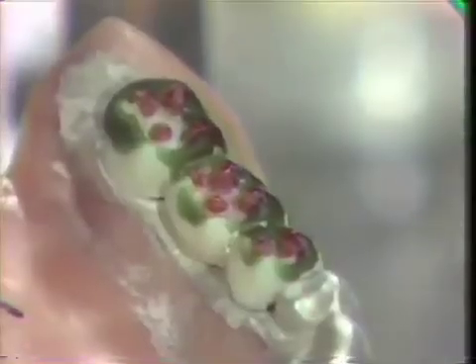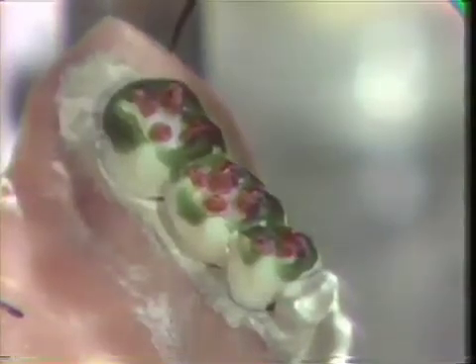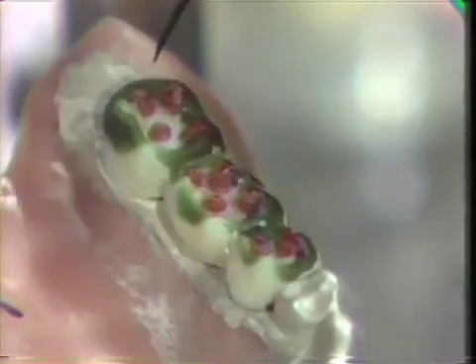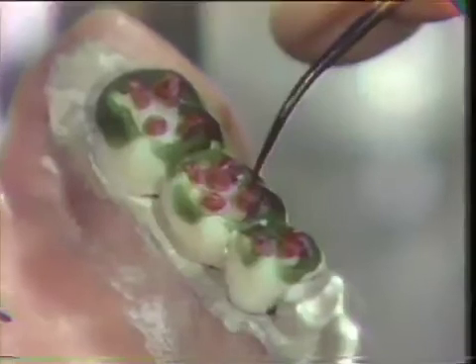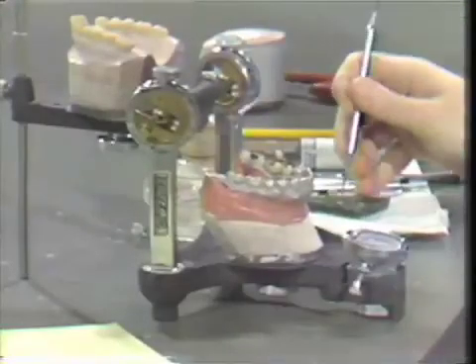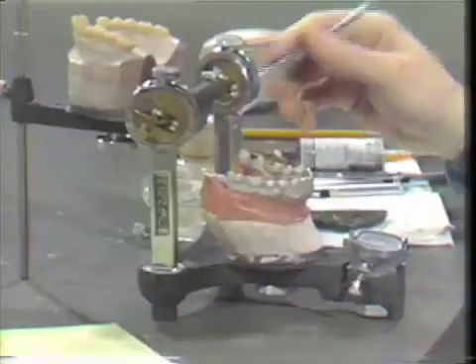We've now completed step number 4, the development of the marginal ridges and the cusp ridges on our mandibular wax-up. And we'll move on now to step number 5, whereby we'll be creating triangular ridges. You'll recall that the triangular ridges run from the tips of the cusps down toward the central developmental groove of the tooth. Here again, we'll be using some green wax to form our triangular ridges. And each time an addition is made, we will again dust the area with zinc stearate, close the articulator to ensure that we do not have any interference.